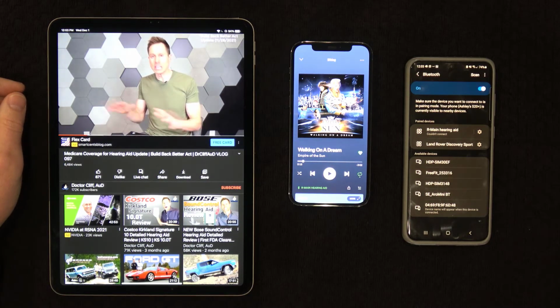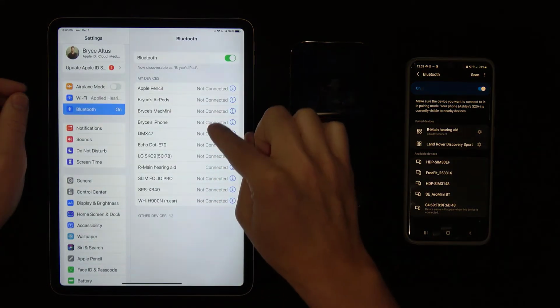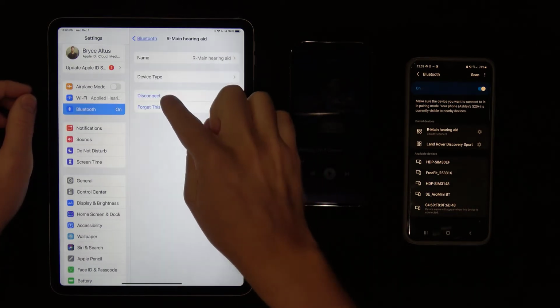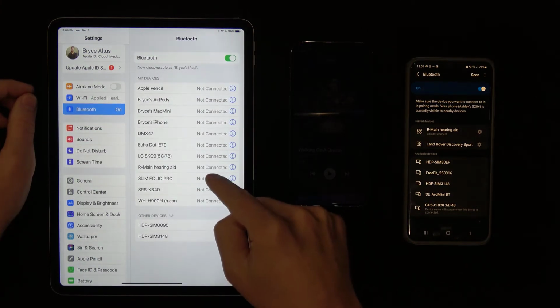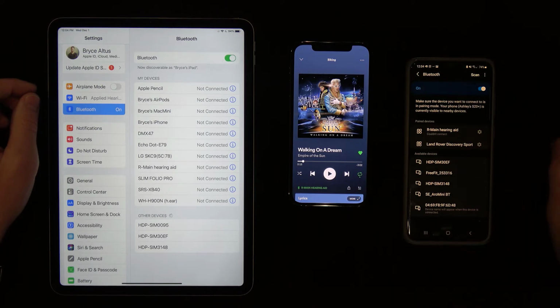To disconnect, you can do it two different ways. You can go to the hearing aid in the Bluetooth menu of the iPad or the iPhone, tap on the blue I button to the far right of the device name, then tap on Disconnect. This will disconnect the hearing aids, but it won't completely forget the pairing that you've already done. Or, in other words, wipe out the Bluetooth connection from the Bluetooth menu altogether. This means that you can simply reconnect at a later date without going through the whole setup and pairing process whenever you want to switch back to this device.